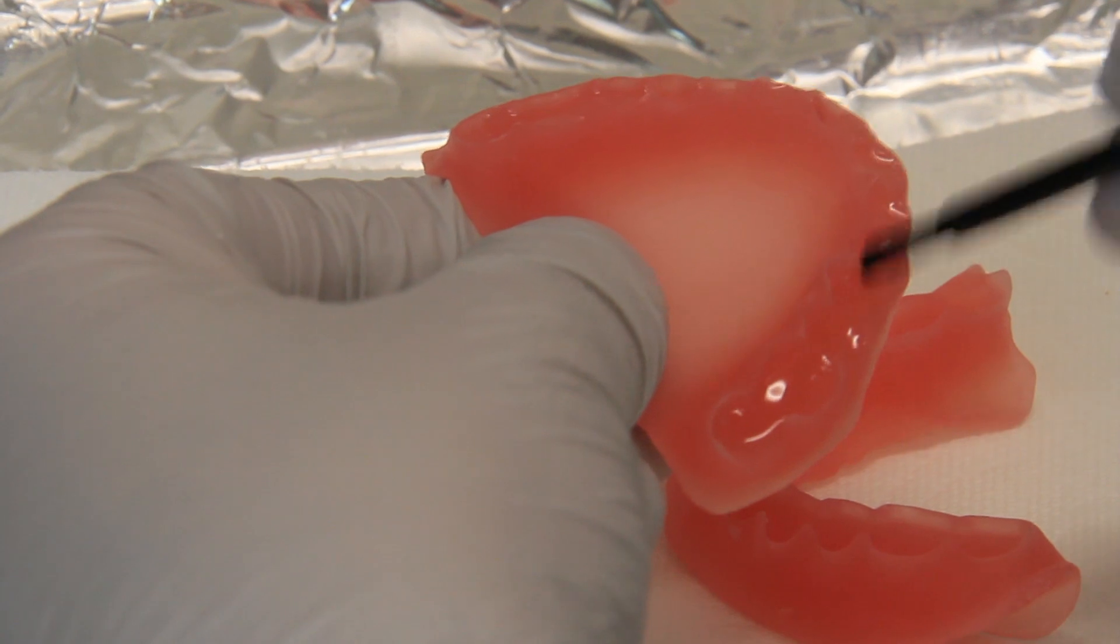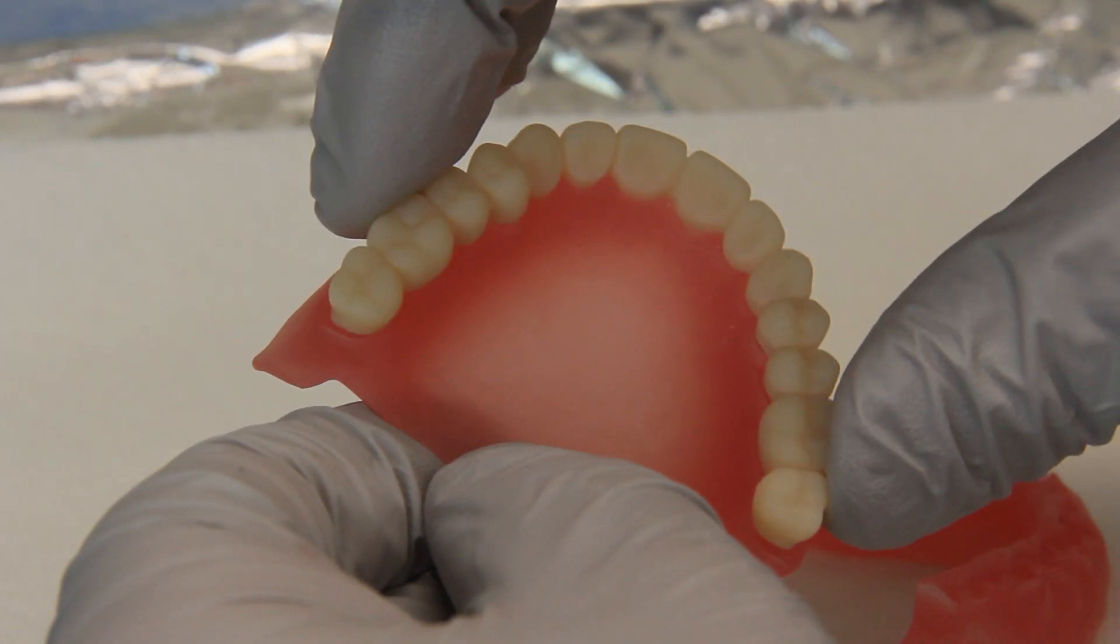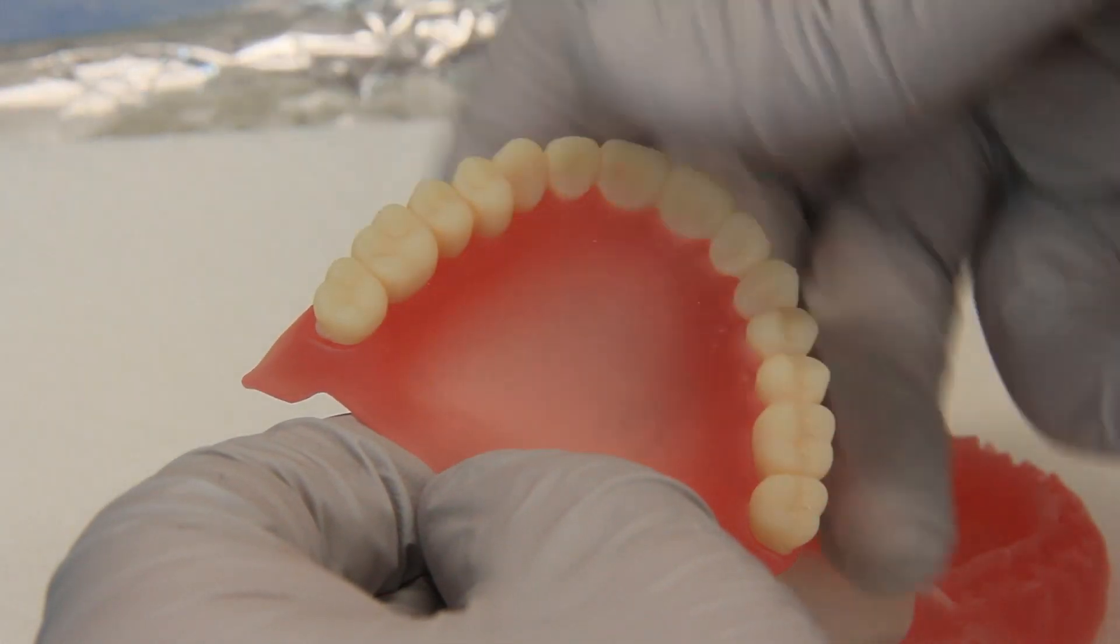After the parts have been printed and cleaned, the teeth are attached to the base with a small amount of resin and a few seconds of controlled ultraviolet light.